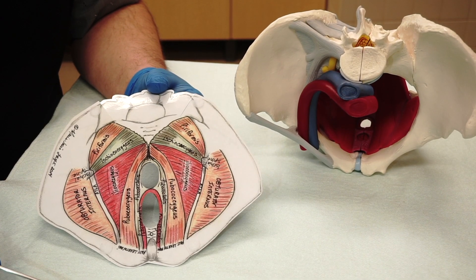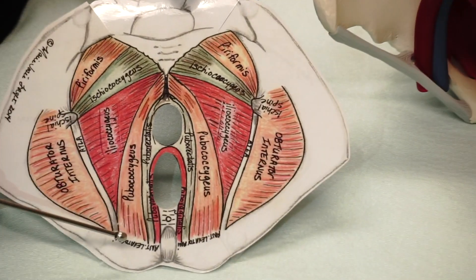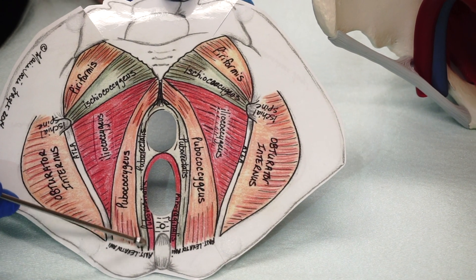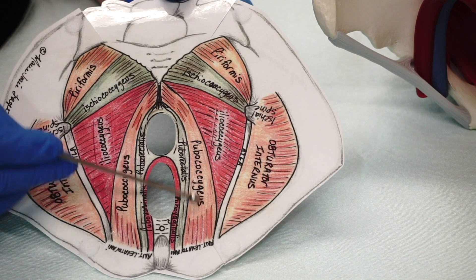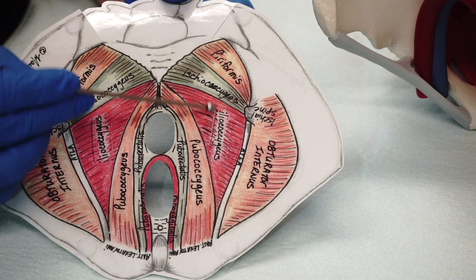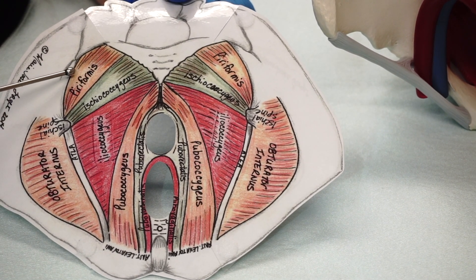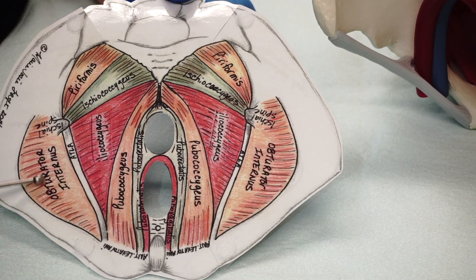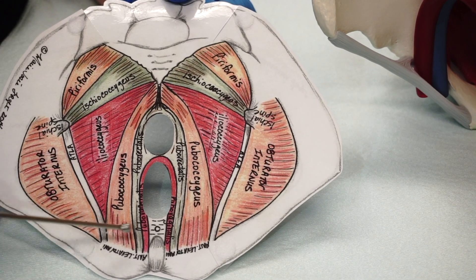Prior to demonstrating injections on the model, I'm going to quickly review the pelvic floor muscles. Starting medially: pubovaginalis, puborectalis, and pubococcygeus. Going more lateral: iliococcygeus, deeper ischiococcygeus, quite deep in the pelvis is piriformis, and lateral on the side is obturator internus. We will demonstrate injections to all those muscles shortly.